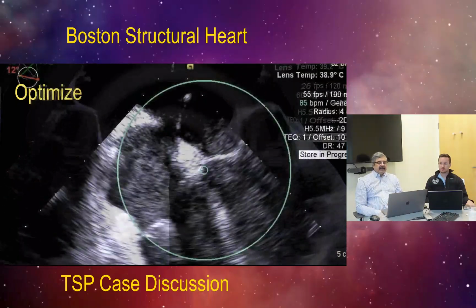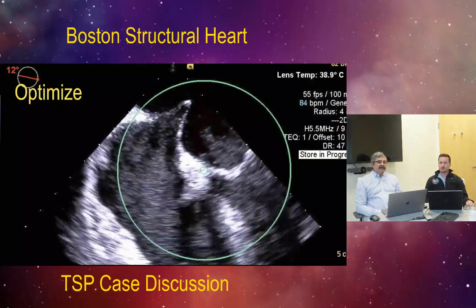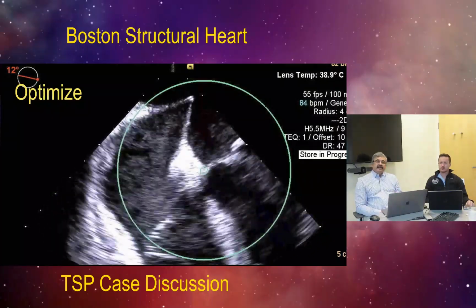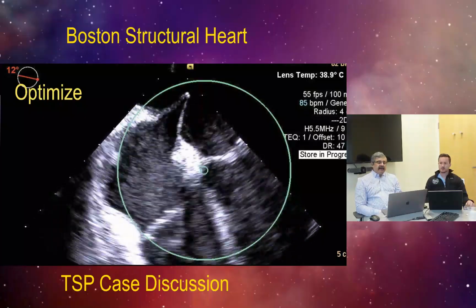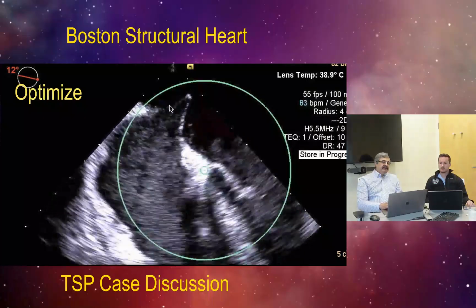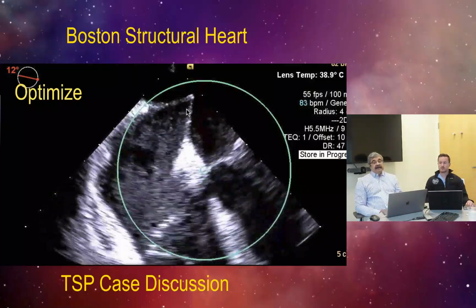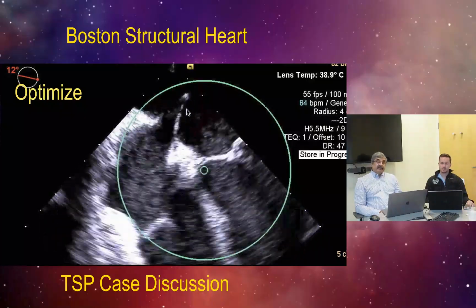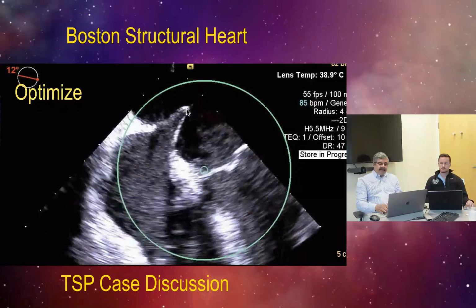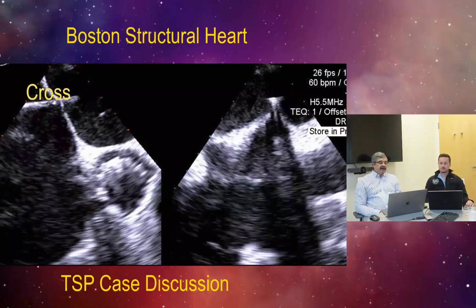And lastly, we determine the so-called height, which, to me at least, is a misnomer. That is the annular distance from the mitral annulus of maximal indentation before they cross. And again, as you can see, the caveat being that if you miss these two edges of the septum, you may think that the septum has already been crossed, whereas it has not been crossed. So you have to clearly demonstrate before crossing that this into the fossa ovalis is completely indented, and then you finally cross in real time under direct vision.